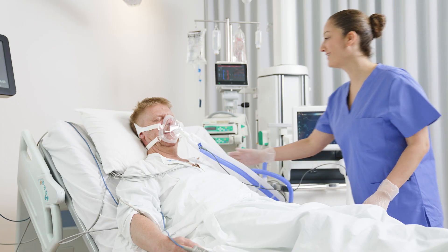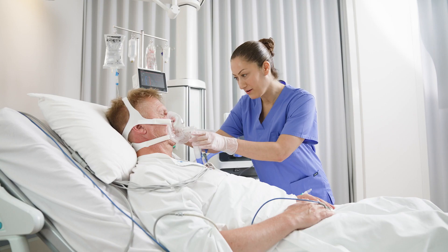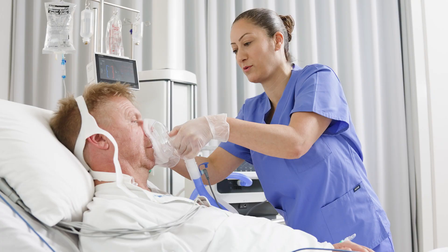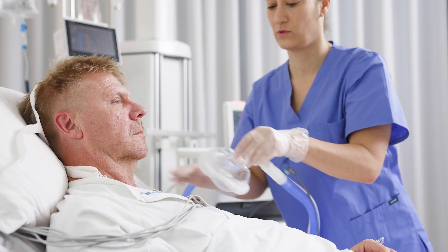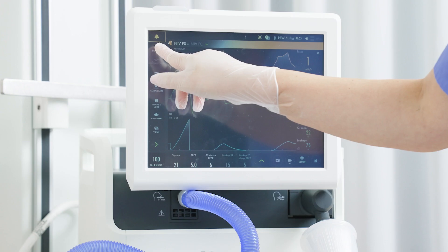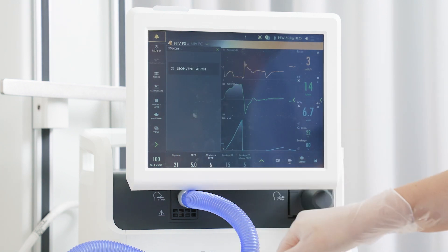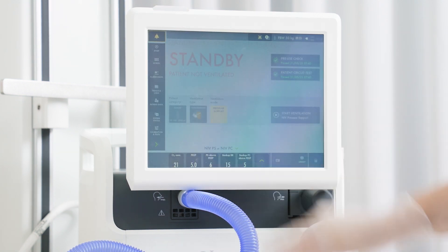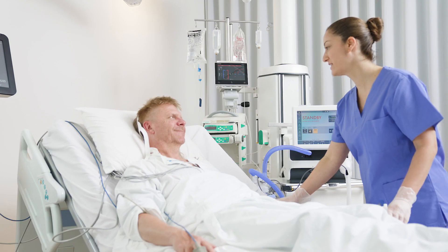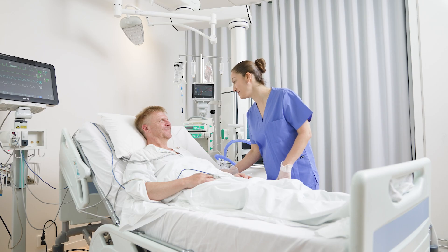To stop non-invasive ventilation, remove the patient interface. Tap the standby tile in the upper left-hand corner on the screen. Then tap and hold Stop Ventilation to go into standby.